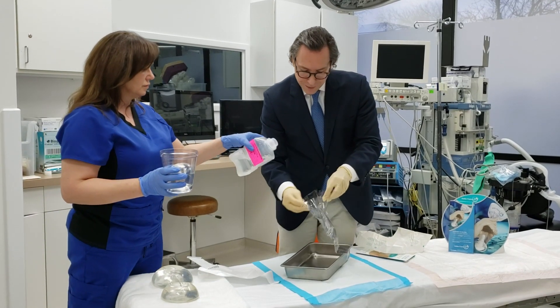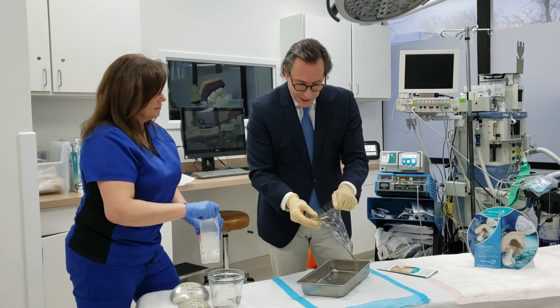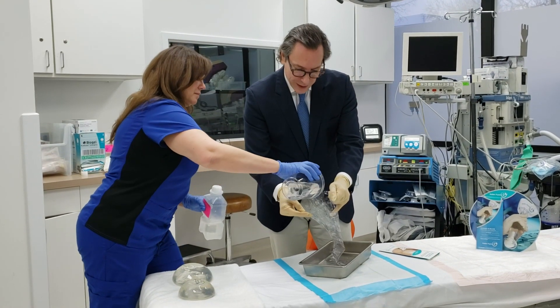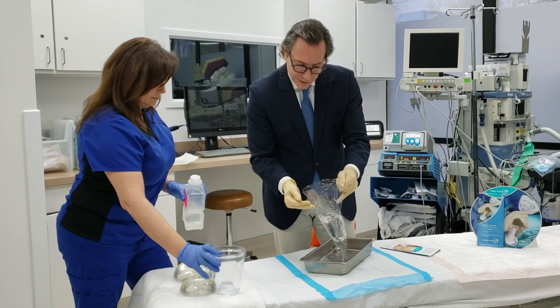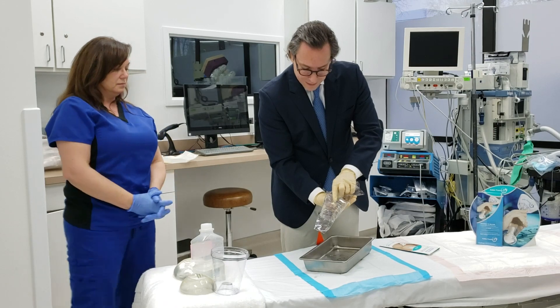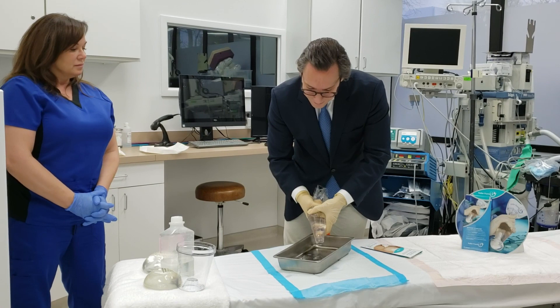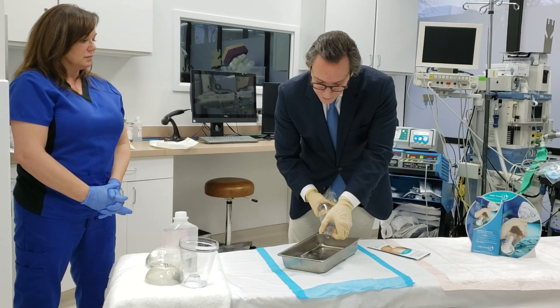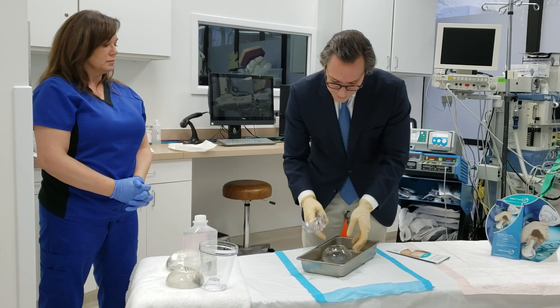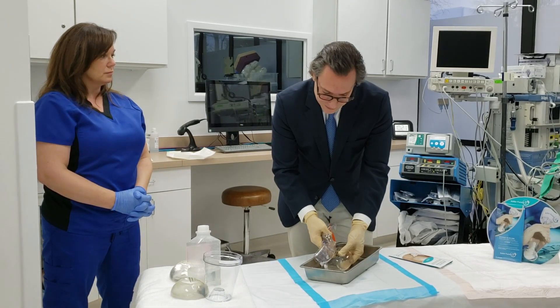Why don't we go ahead and put in a little bit of irrigation into the funnel — this activates the lubricant. Once you've activated the lubricant inside the sleeve, with the no-touch technique right out of the box, you can go ahead and put the implant into the Keller Funnel. You then orient the implant itself with the label being on the bottom, and then through the tiny little entry, you can insert the implant right into the surgical pocket, like so. It keeps the orientation, and you want to check to make sure that is how the implant is inserted.